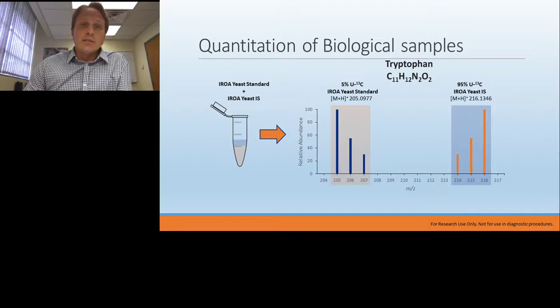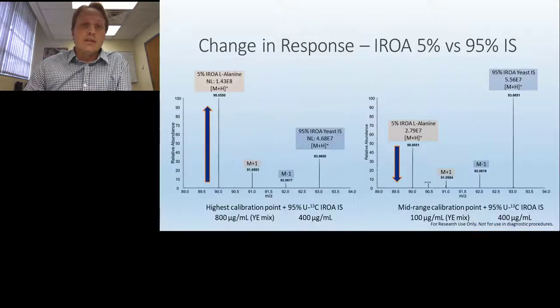And in biological samples, you can do the same thing. That was just looking at a bunch of standards. And here you can see this just shows what it would look like with tryptophan again. And again, that change in response that you might see.